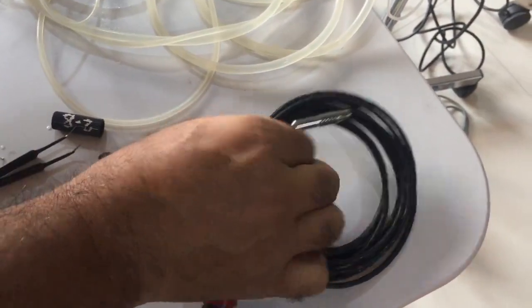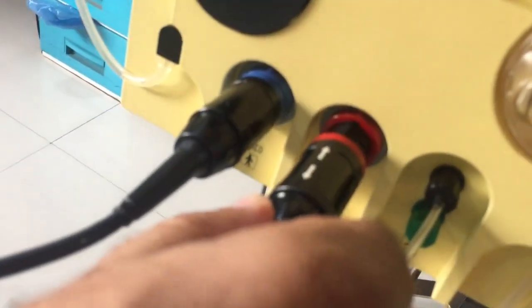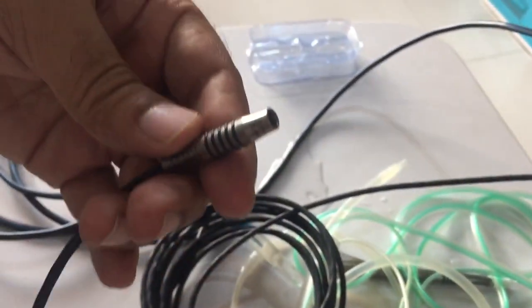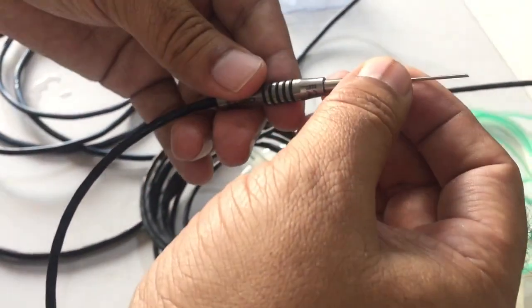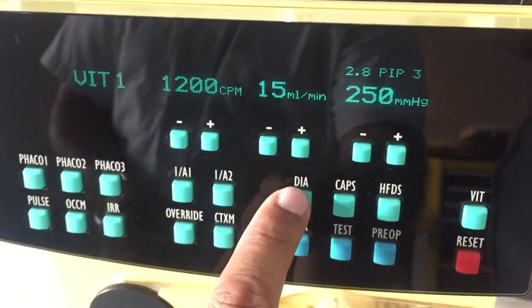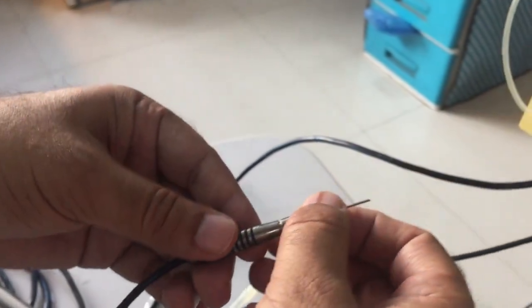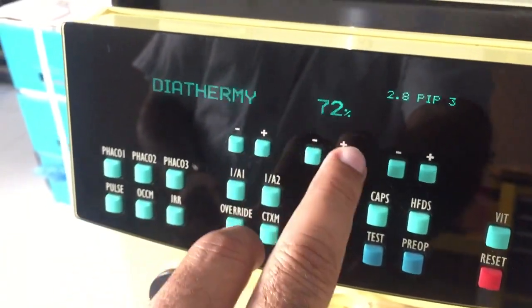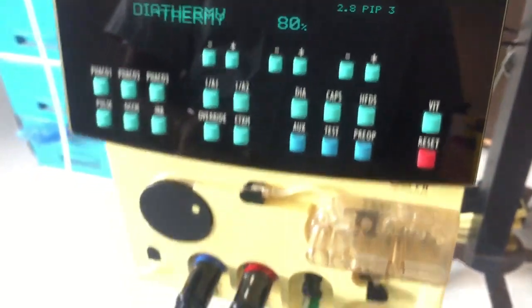Here is the handpiece for the diathermy, and the diathermy handpiece has one connector, and this is the port for the diathermy. You can connect the diathermy handpiece connector with the machine, and the other end is the handpiece, and you can connect any diathermy instrument like bipolar forceps, like eraser tip, or you can use the capsulotomy tip for the capsular access. For diathermy, you press the button here, dia, and you will get the function on the display. And then you can use the diathermy eraser tip here, and you can adjust the power from 0 to 100% on the panel with these two buttons. So your diathermy is ready.